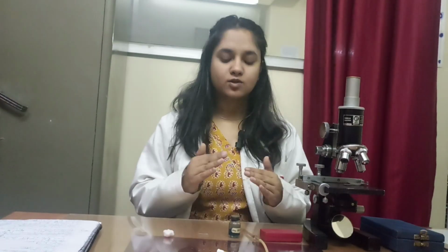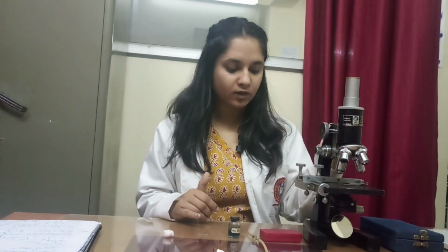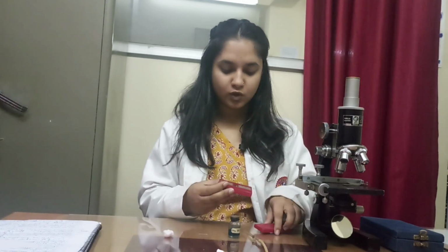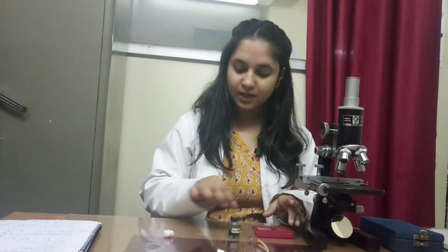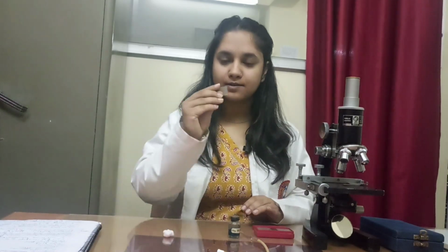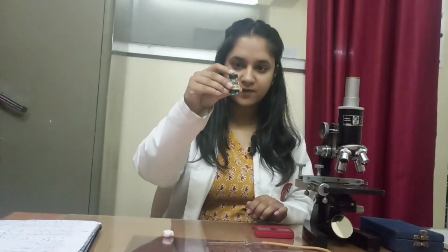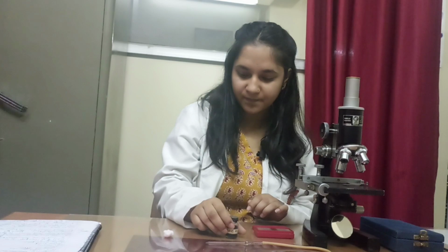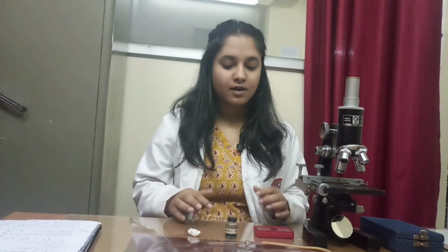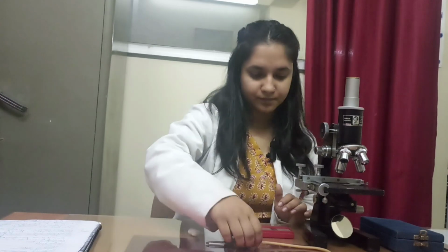The instruments required to perform this experiment are, first, a microscope. This is a compound microscope. Then second one is a Neubauer's chamber. Third one is a cover slip. Fourth is a WBC pipette and Turk's fluid. This is the WBC fluid which is known as Turk's fluid, and cotton. And then second, we see how we perform this experiment.